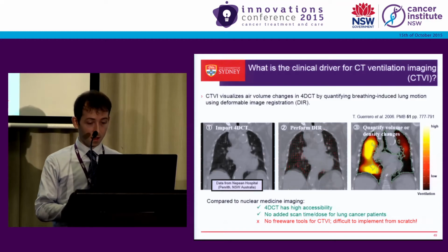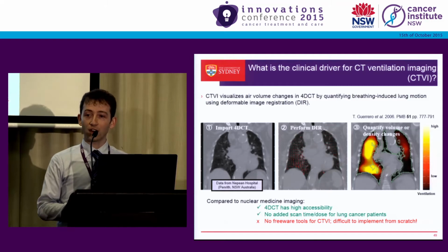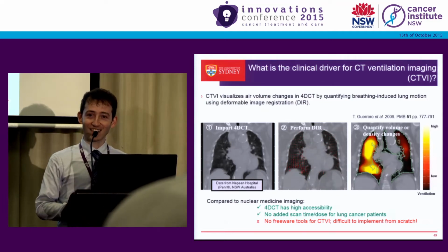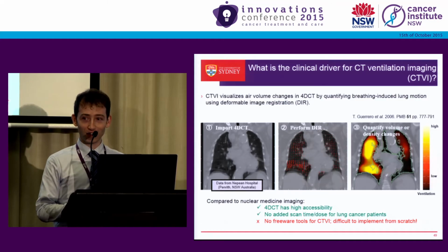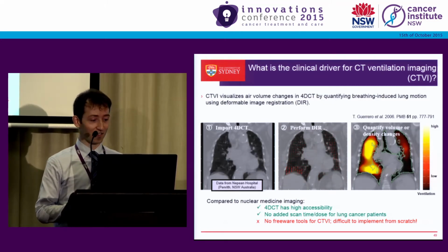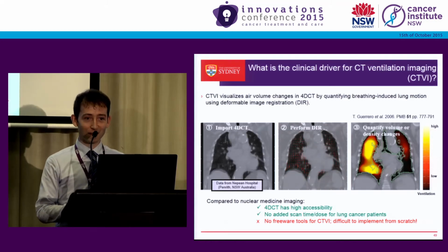The challenge for the clinic, at the clinic level, is that there are no freeware tools out there to do this. You have to develop the workflow yourself. And I speak from experience when I say this can take a few years to get all these components talking to each other. You're talking about importing images from DICOM to other imaging formats, performing lung segmentation, deformable image registration, getting regional Jacobian determinant image matrices.